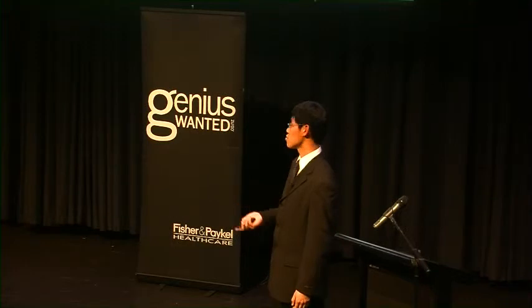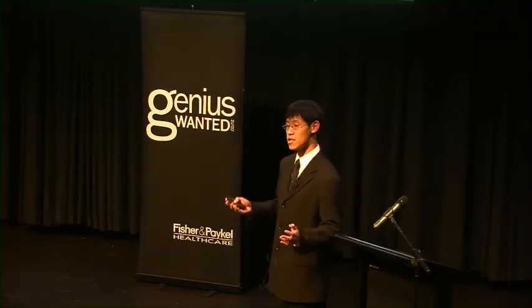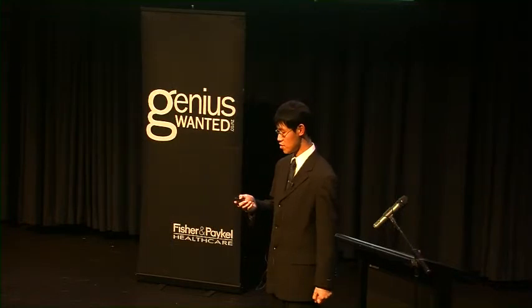Now, the reason for doing this is because of the idea that any scan sequence is really a whole bunch of step changes. So if we can describe the background phase for a single step change, then we can just use superposition to find the resultant background phase for any scan sequence. Of course, the output of the scan is an image, so we also get spatial information.